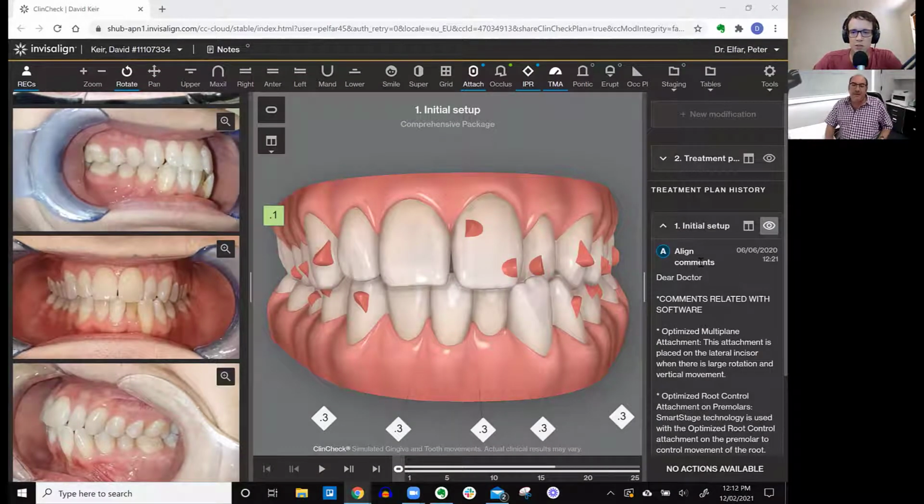Today, we're lucky enough to be joined by Dr. Jeff Hall, of course, the founder of OrthoEd. We're going to be going through a few steps over the next couple of episodes where we're going to do the diagnosis of my ClinCheck. We're going to talk about the risks that you should be thinking about, just broadly, and then talk about the changes that Jeff would actually make to my ClinCheck as the first steps. So welcome to the segment, Jeff.